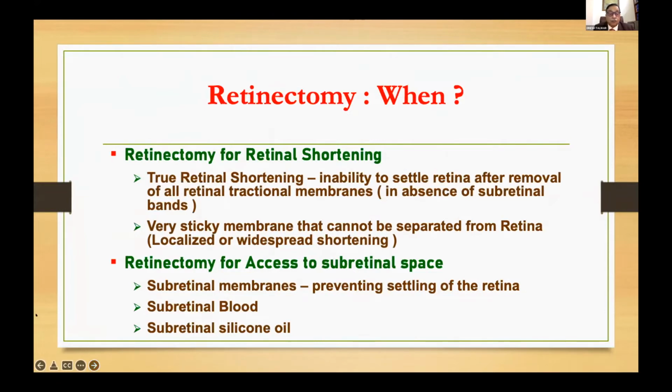I tried to put all my thoughts of how. I'm sorry, I apologize. Safely and efficiently. Sorry. So let's get started. Paracentesis, peripheral as you can, out of opening the conjunctiva. I apologize. Is there a problem? No, it's my problem. I'm sorry.